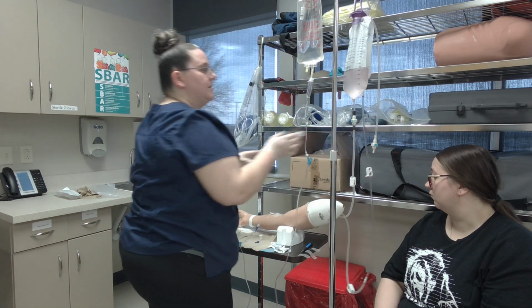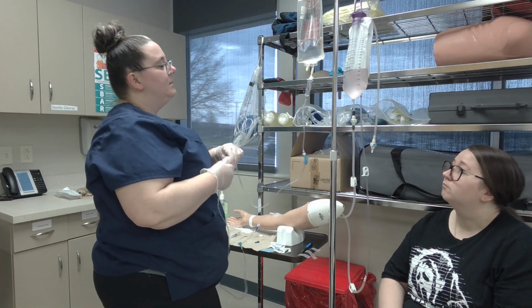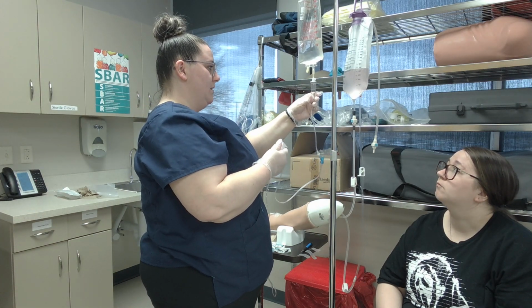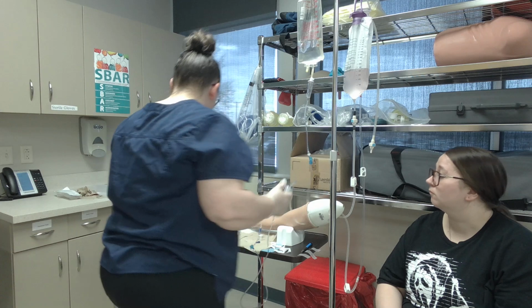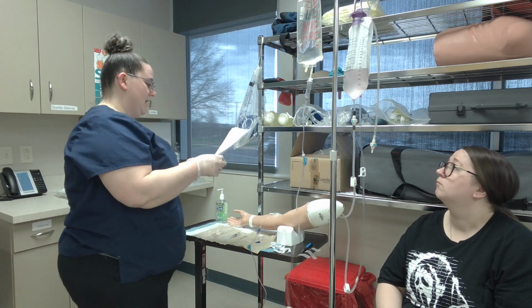And then I will start my drip rate. And I don't think I'm going to be able to get my drip rate on here just because my tubing is not working. But I will state that I would leave this all open after I get my drip rate correct.